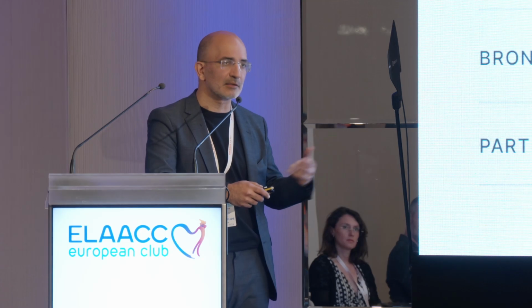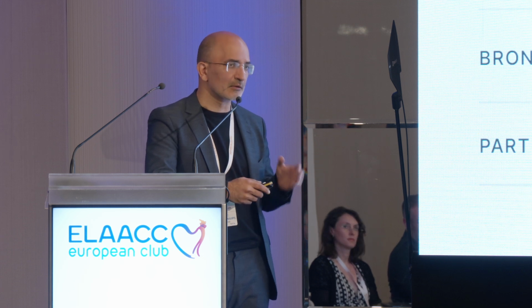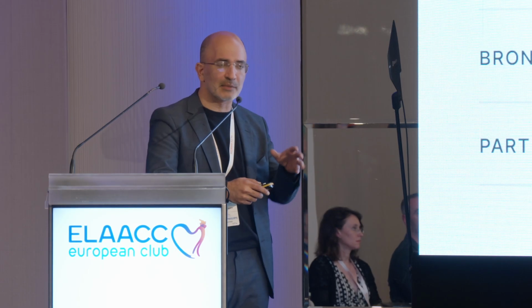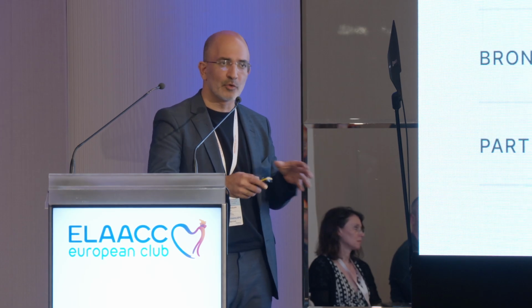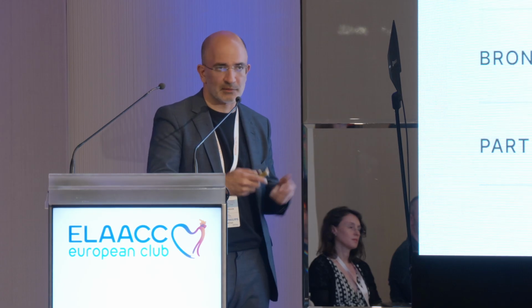It was considered during the discussion, during the first ELAACC meeting, but we decided that it would add more complexity to the whole scoring, which is already complex with 12 variables. So we decided not to include transseptal. Although I agree that it's part of the complexity, it doesn't say anything about the anatomy of the appendage. So we wanted to keep something really focused on the challenging anatomies. But if you are thinking of an optimal implant, maybe in the future you may have to consider it.